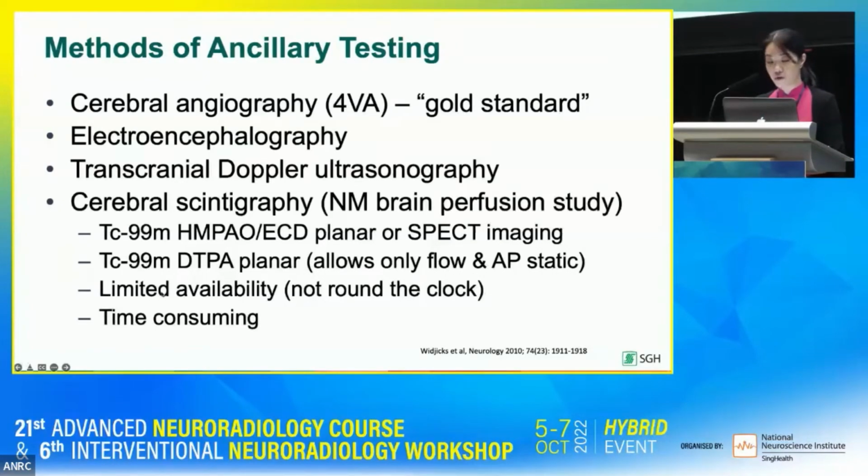The drawback of using scintigraphy is that availability is limited because it's not round the clock, because usually the hot lab preparing the doses does not work 24 hours a day. And also it's time consuming because you need to prepare the tracer and then send the patient down with staff support and do the scan.